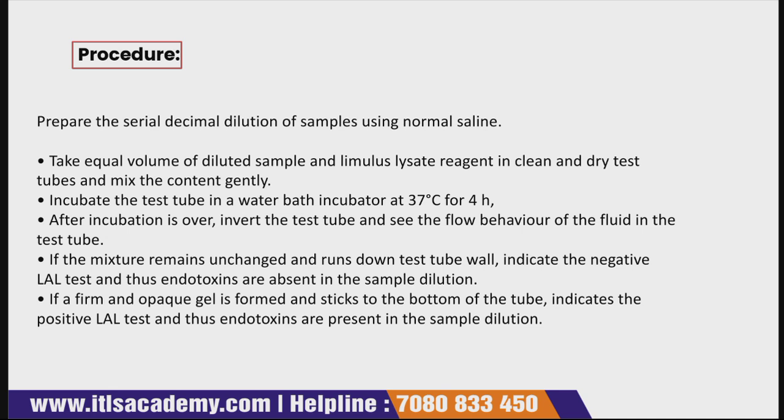This point is very important. So what does it indicate? A negative LAL test, and this clearly indicates that there are no endotoxins in the sample dilution.